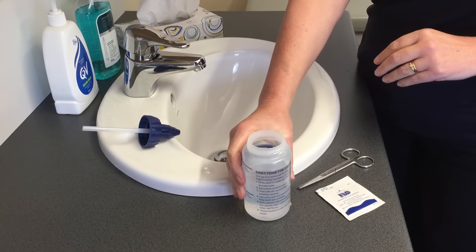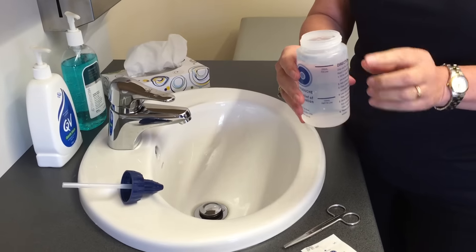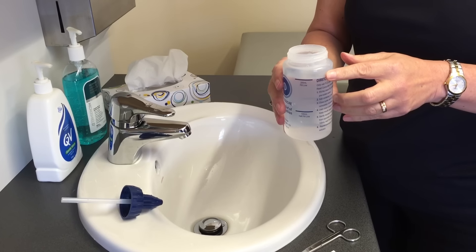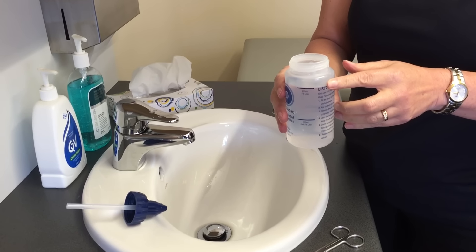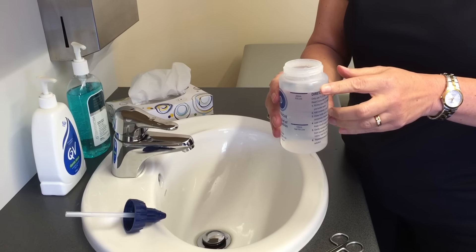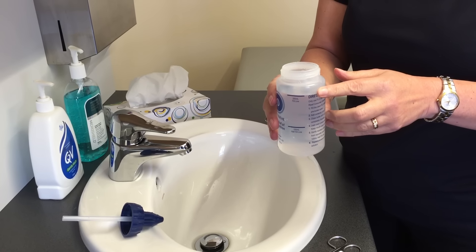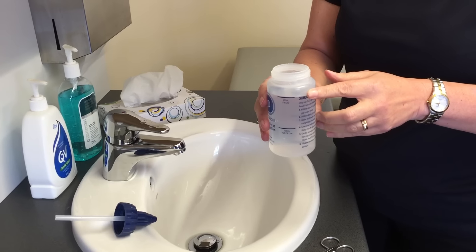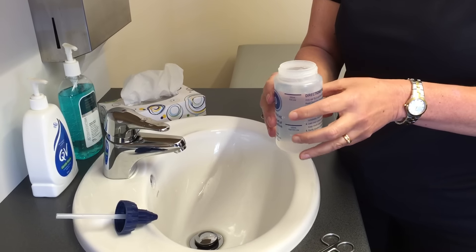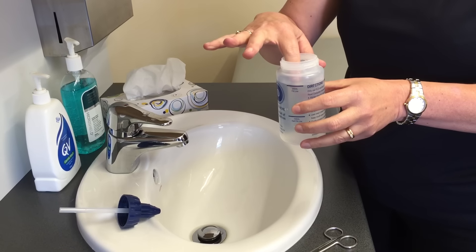Fill the bottle to the 200ml fill line. If you've recently had surgery, it's important to use boiled water from the kettle. The water temperature should be around the same temperature as your body — not too hot and not too cold. If the water has cooled too much, you can reheat it in the microwave for 10 to 20 seconds. Always check the temperature of the water before using by placing your finger in the bottle.